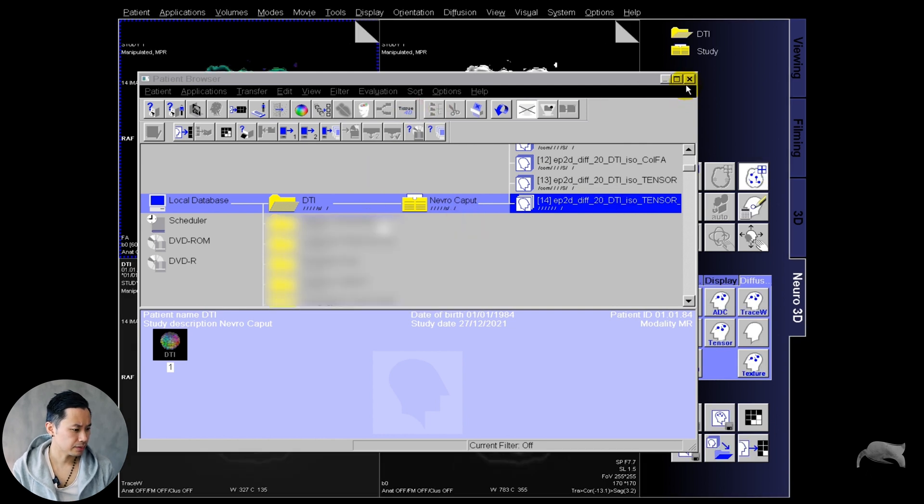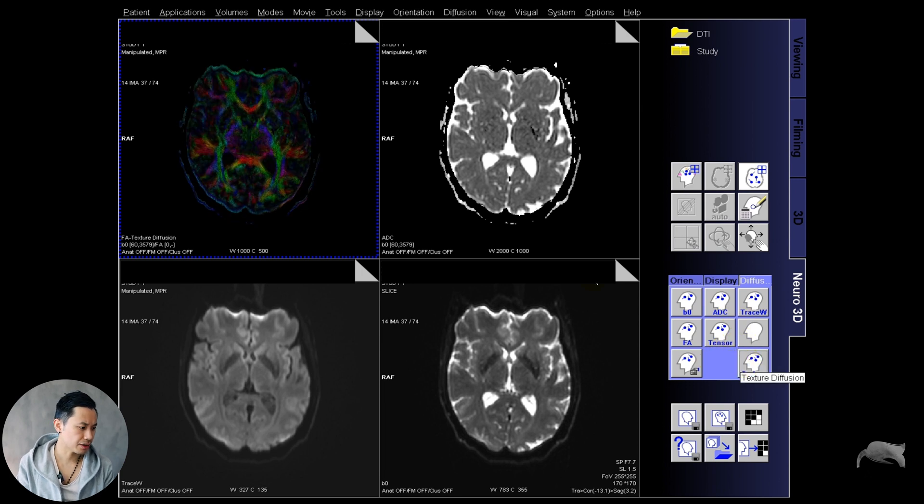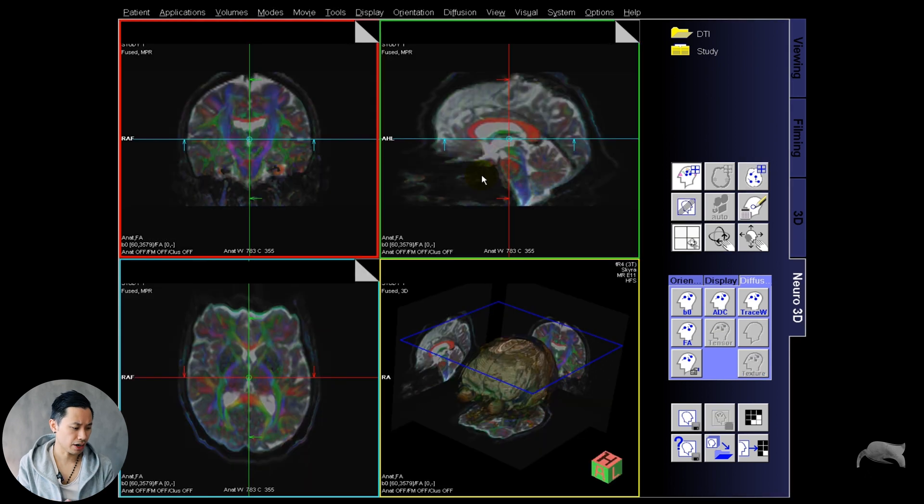Let's check it out. You have the FA map, ADC, the trace, everything. You have different options you can tick on or off for the texture. Just test out what you need and don't need. We go into the fusion mode, that's where we can do the DTI tracking.